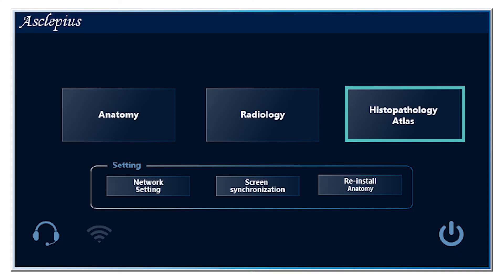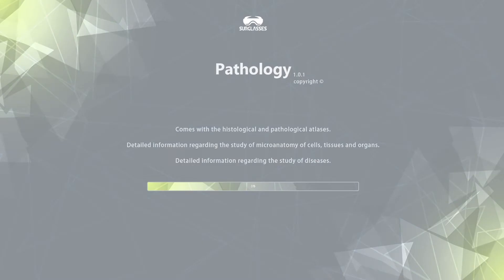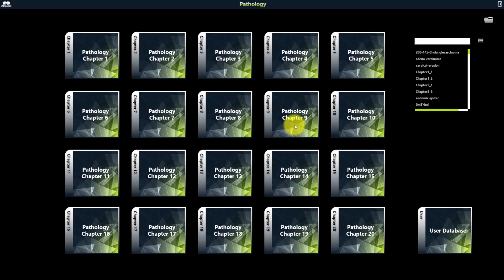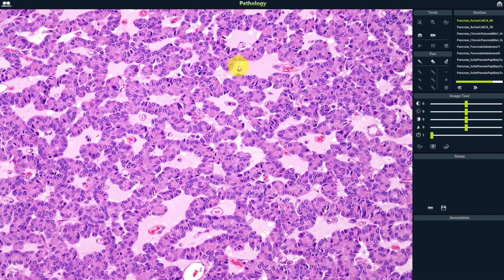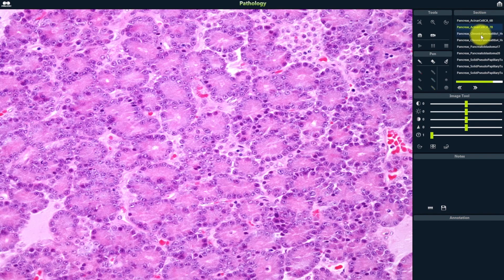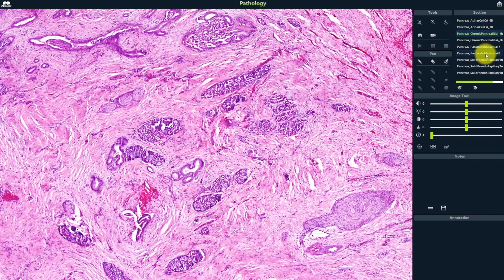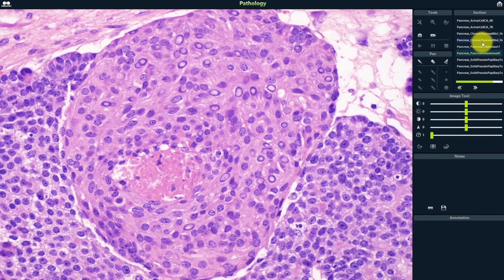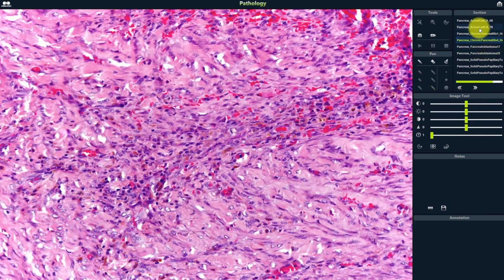The last package is the histopathology atlas, which consists of two parts — histology and pathology — with more than 400 case examples of real patients.